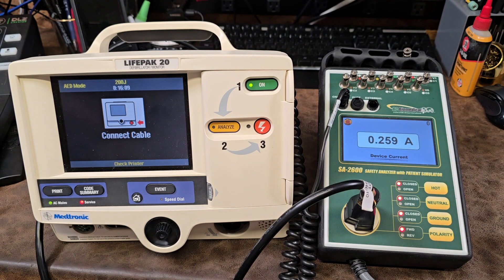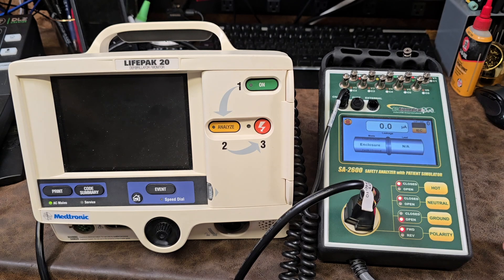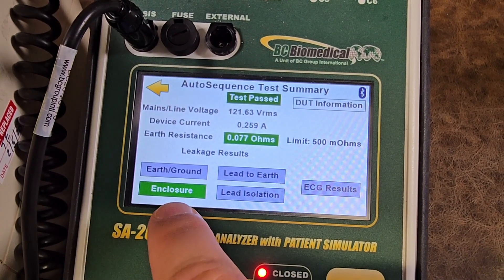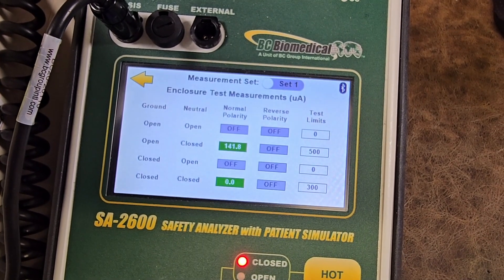Once my timer expires it'll take a current measurement — there we go, 0.25 amps. Then it's going to pop into leakage and automatically test all the leakage levels. The next step tells you to turn off the device, then hit continue and it repeats those measurements. When the device is done, you get a nice readout showing all the different results, and if there is a problem the color will change — it'll be red if it doesn't pass. You can touch to see individual results.